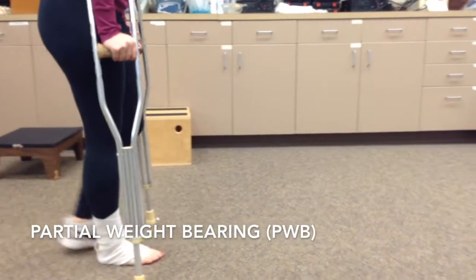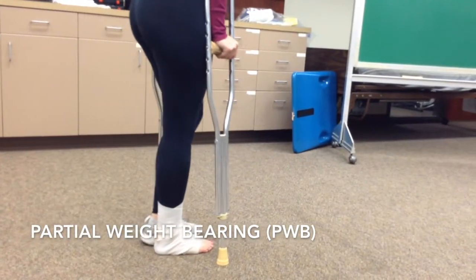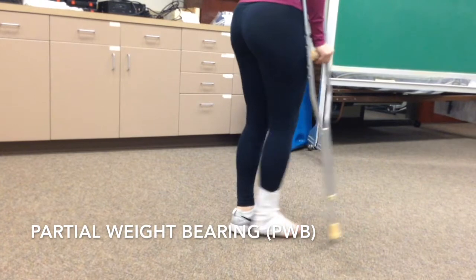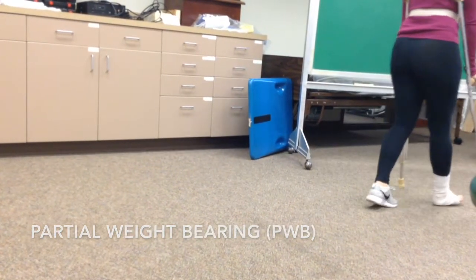Partial weight bearing allows a limited amount of weight bearing on the involved lower extremity. This gait pattern requires 3-point gait that will be discussed in Skill 30.